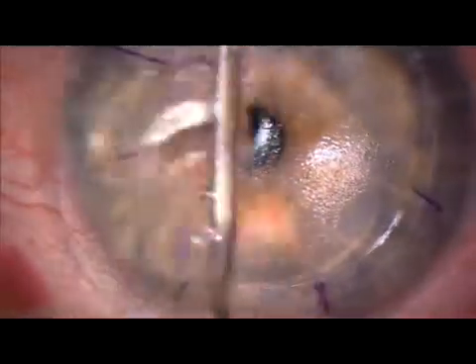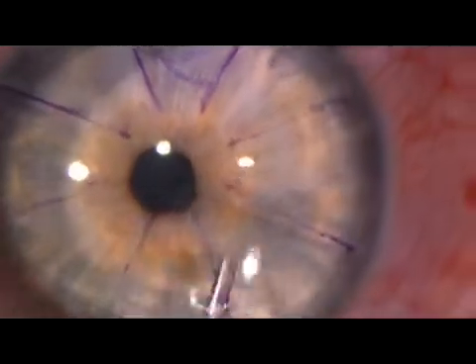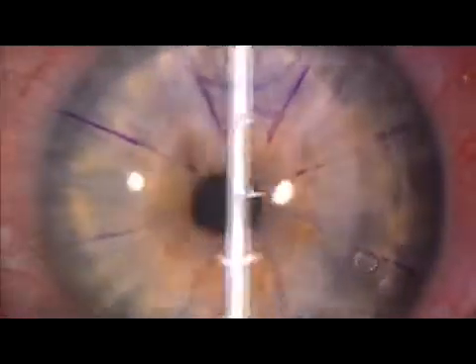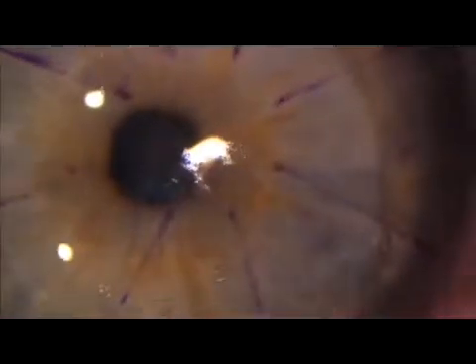I like to float the flap in place and to use the generous markings to ensure an optimal fit. Bubbles can be seen in the interface and are easily expressed.